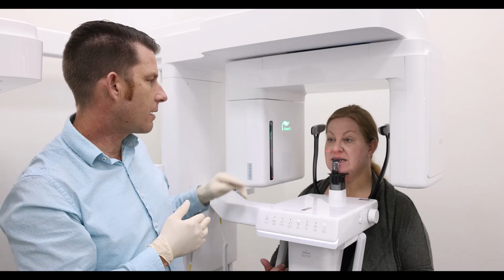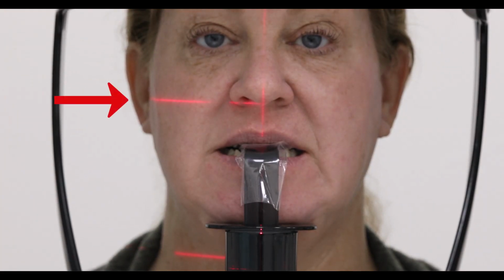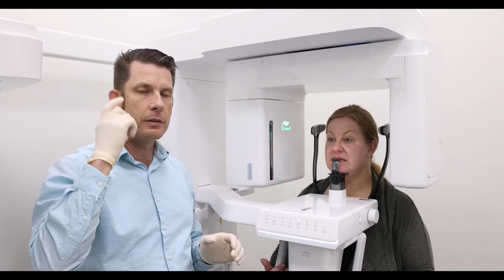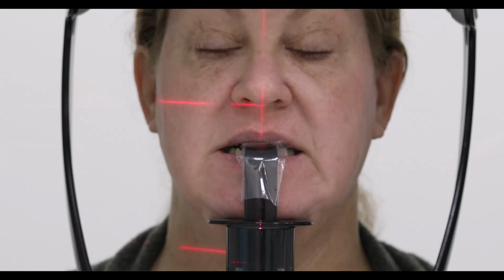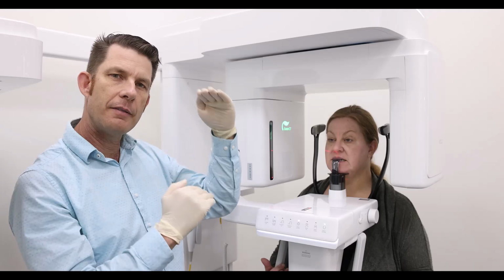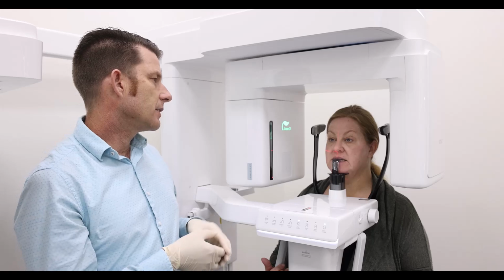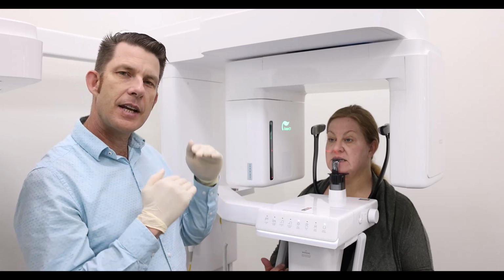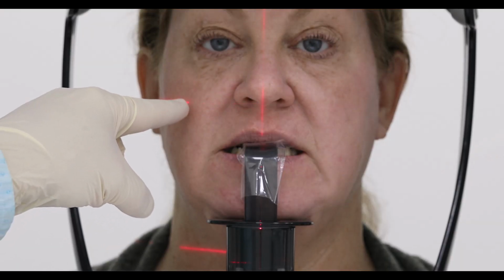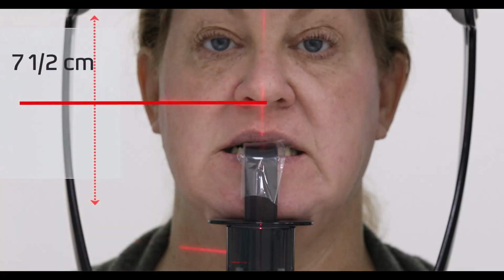Couple things to note. We have a horizontal beam shining on the right side of the patient's face. Depending on the field of view you've chosen, depends where that horizontal beam will be located. The important thing to remember is that the horizontal beam is the center of the height. So if we have a 15 centimeter in height scan, the horizontal area above this, we're going to be capturing 7.5 centimeters above and 7.5 centimeters below.